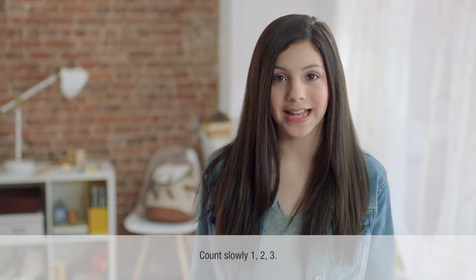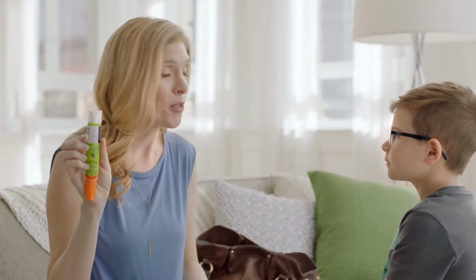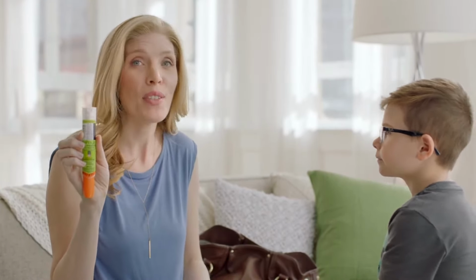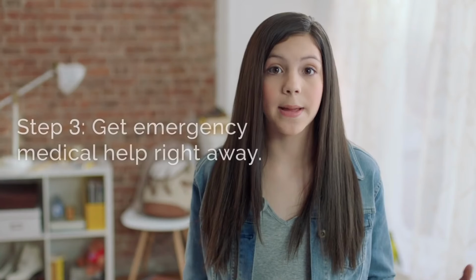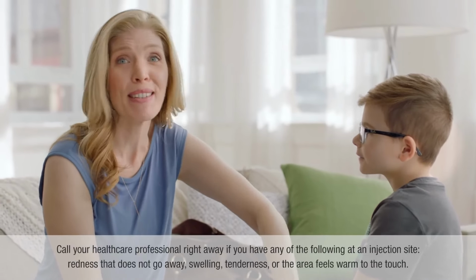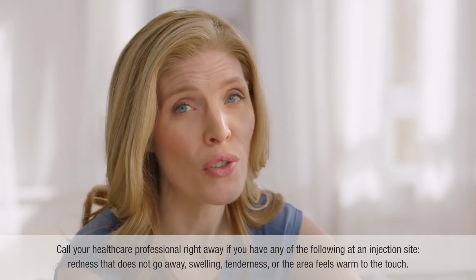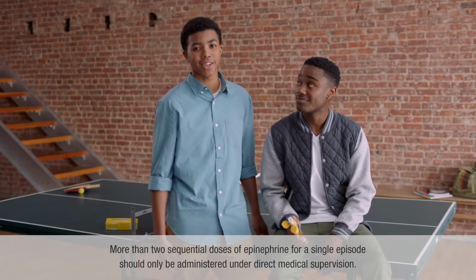Then you hold it there for 3 seconds. Then, remove Epi-Pen. you'll still see some liquid in there, but don't worry, your Epi-Pen Junior auto-injector gave you the right dose, and it has a special feature, the never see needle. Yeah, so the needle's totally covered up. So you should never see the needle. Then rub the spot for 10 seconds while you or someone else gets emergency medical help right away. Call an ambulance. Or have someone take you to the emergency room. Just make sure to do it immediately. And you should always carry 2 Epi-Pen auto-injectors wherever you go. They even come clipped together. Because some people might need the second dose.